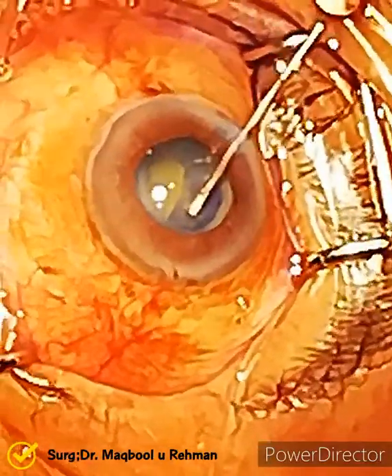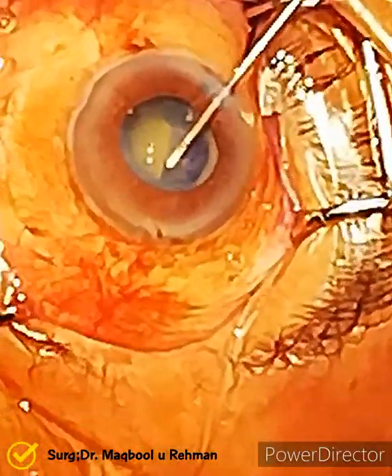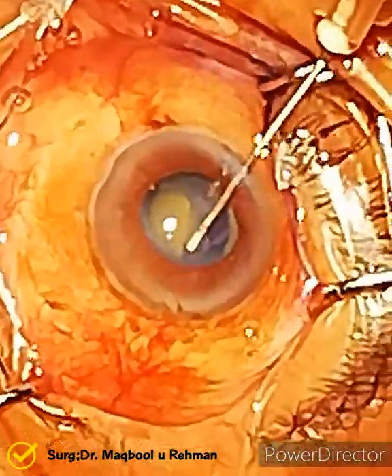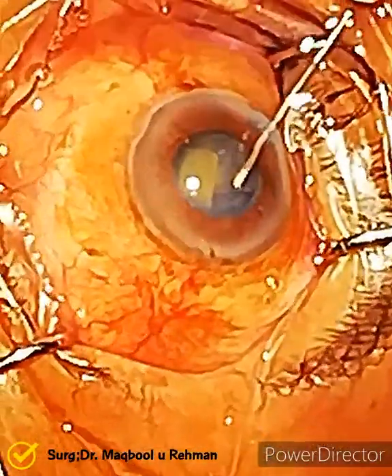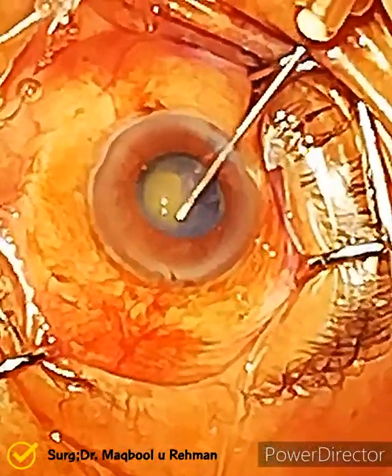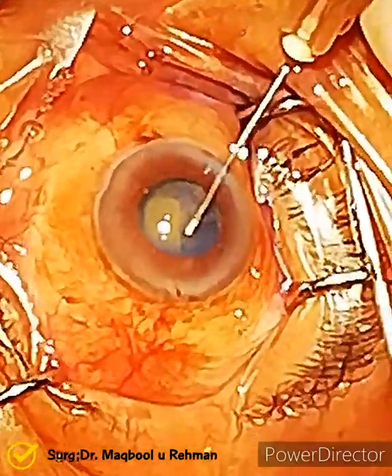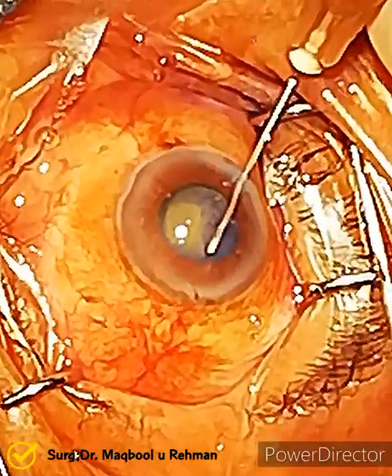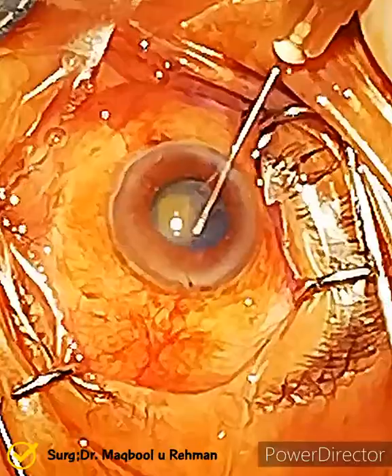As there is no cortical matter in the bag and the nucleus is very small, it is almost empty. The surgeon is in a very difficult spot. I think he should try the capsulorrhexis forceps, as the cystitome is not helping him out.